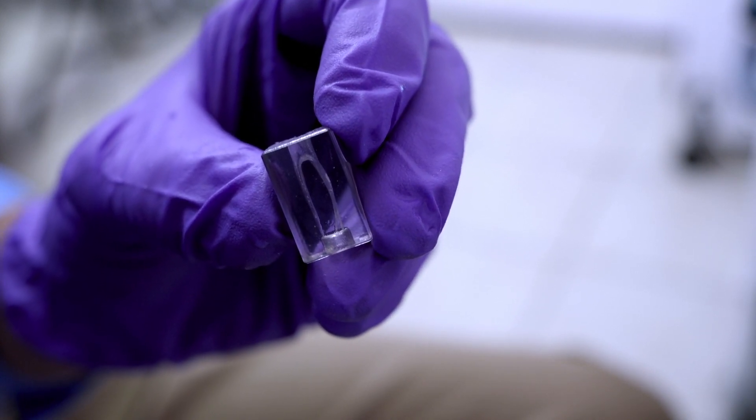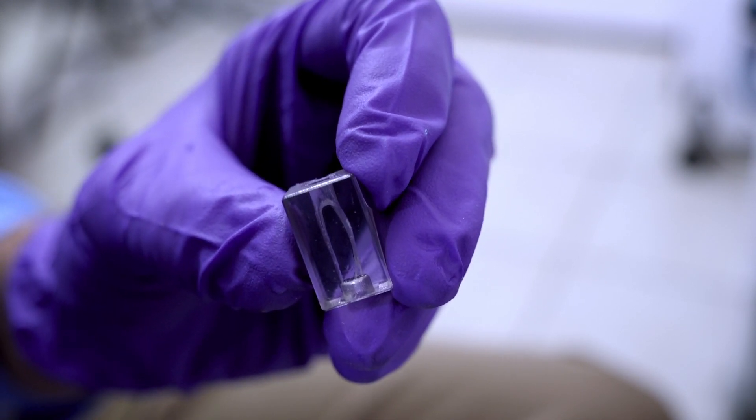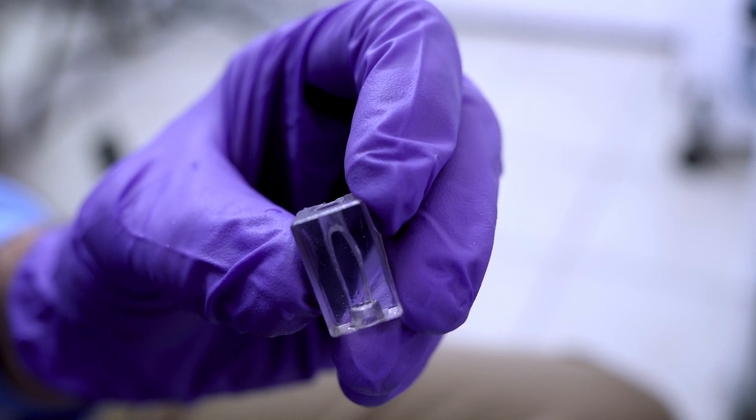That's how powerful this laser is. And it's a game changer in root canal therapy because it cleans out all the bacteria and biofilm and toxicity associated with that in these old root canal teeth.